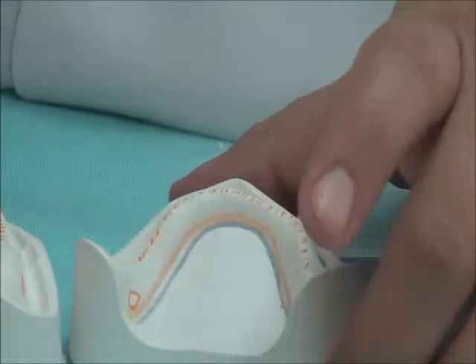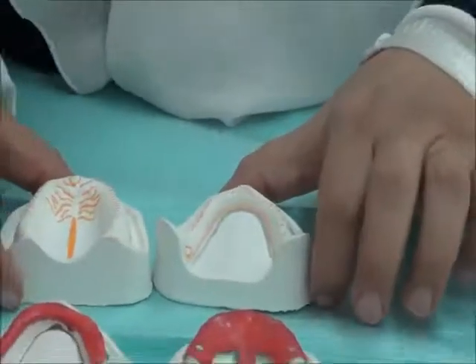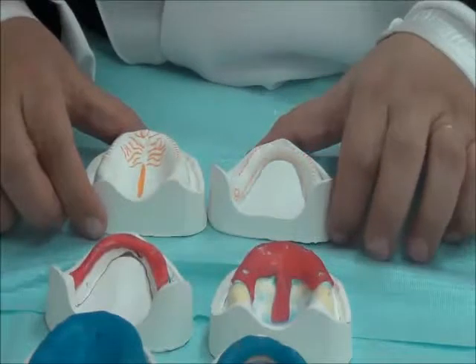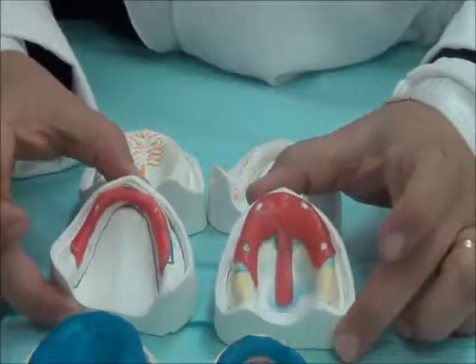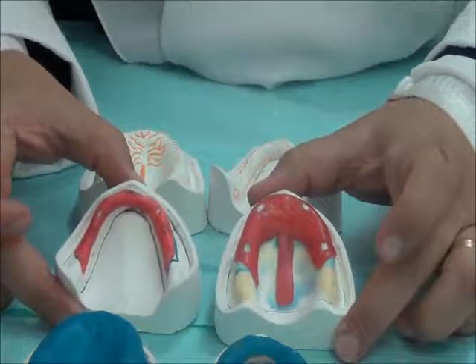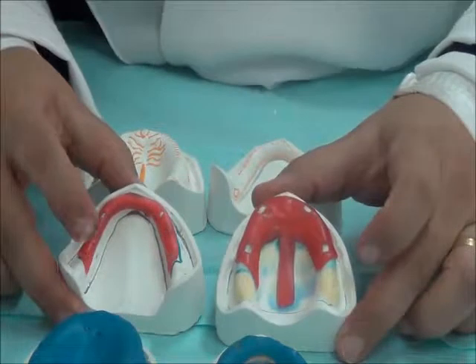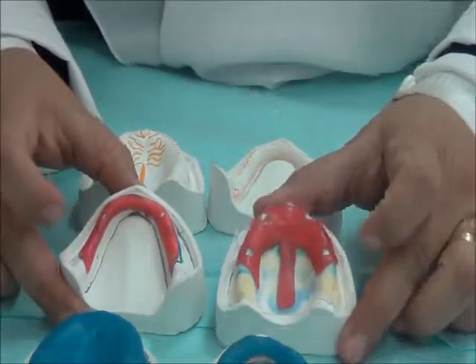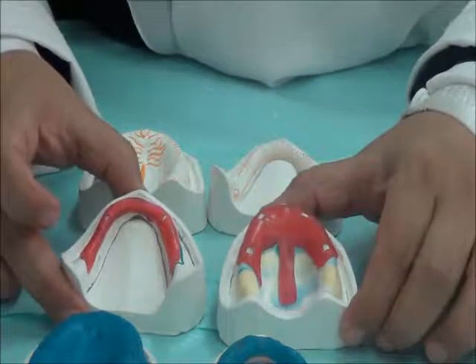Now, for us to make the tray not press too much on the tissue while taking the impression, and this is called selective pressure technique, we can do more than one procedure. We could either select the areas where we pressurize and the areas that we want the impression to be static by placing the wax beneath the tray. So if I make a tray material, hard tray material over this wax, in the areas where we have wax, the tray will not come in close contact with tissue.